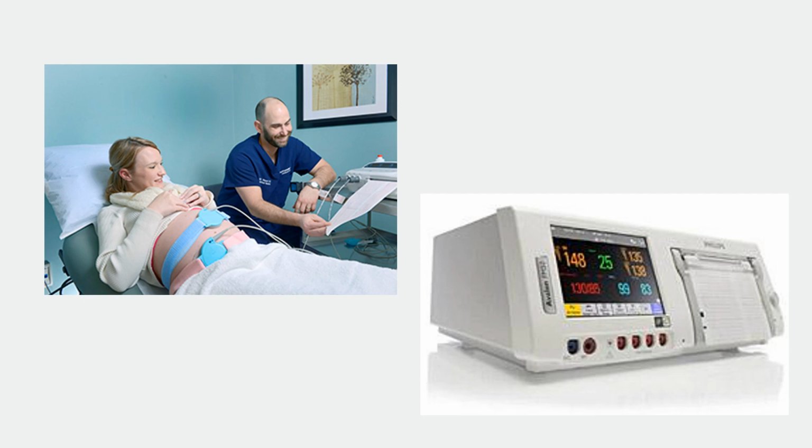So you can see there on the left, you have a lady there. She's got two straps on her belly. The top strap is called the toco, and what that is, it measures the contractions. You can see where it's placed. It's kind of higher up on her belly. This is the fundus. This is the top part of the uterus. Now contractions originate from the fundus and move down. So that's why we place that monitor up high. Underneath that circle is a little button. And when that button gets compressed, when her uterus firms up, that's what creates the bell-shaped curve of the contraction.